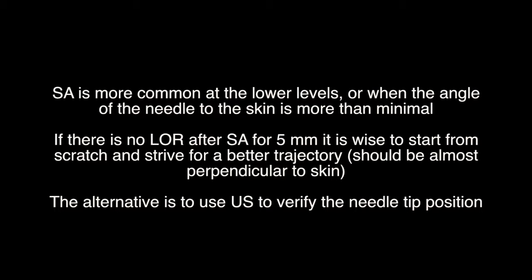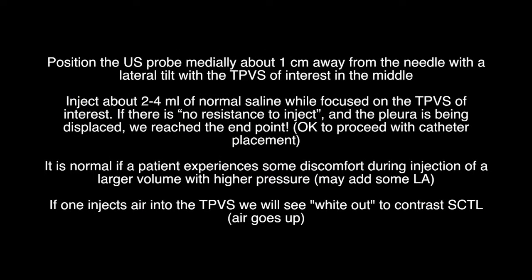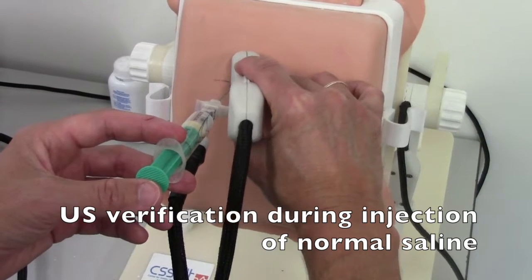The trajectory should be almost perpendicular to the skin. The alternative is to use ultrasound to verify the needle tip position. Position the ultrasound probe medially about one centimeter away from the needle with a lateral tilt, with the TPVS of interest in the middle. Inject about two to four milliliters of normal saline while focused on the TPVS of interest. If there is no resistance to inject and the pleura is being displaced, we have reached the endpoint and it is okay to proceed with catheter placement. If one injects air into the TPVS, we will see white-out to contrast the SCTL.